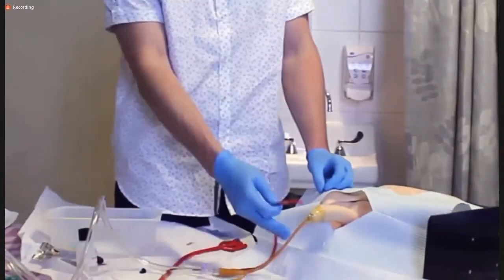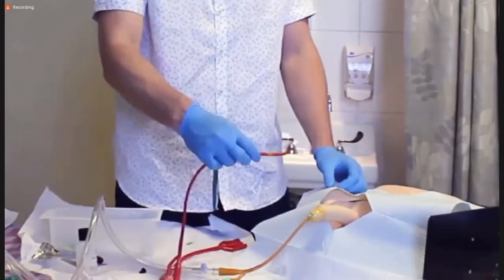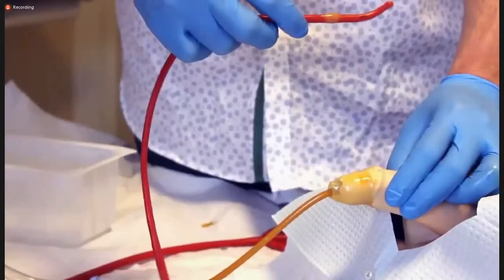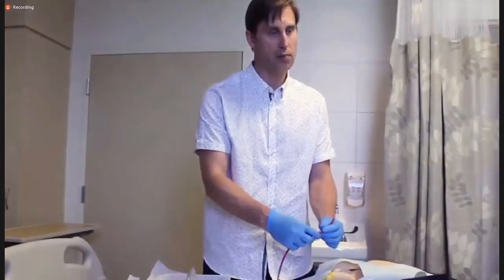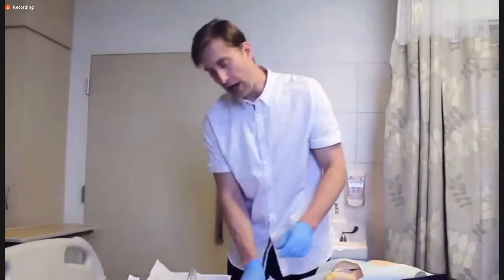So in this instance, in some men with really big prostates, you can't put a regular catheter in. So you'll use a coude tip catheter with the curve pointed upward and place it down the urethra with the tip pointing up. And that will help guide the catheter up and into the bladder in some difficult catheter scenarios.